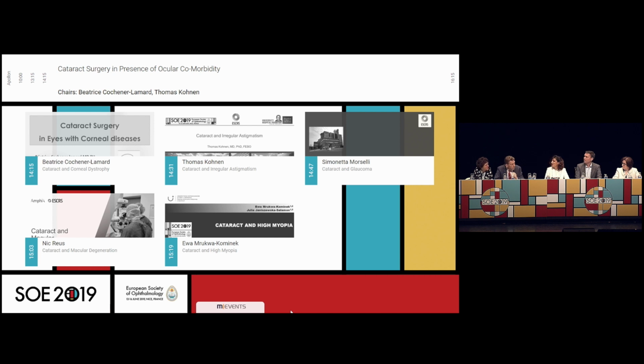Yes. Eva, in high myopes, blue lens or not? No, white lens. Okay, white is good. Then another question on high myopia. A big problem during surgery is usually the fluctuation in the anterior chamber. Can you give some recommendation for the audience, how do you deal with this factor? Because in particular, in a 50 dioptre myopic case, it can be a really big problem.